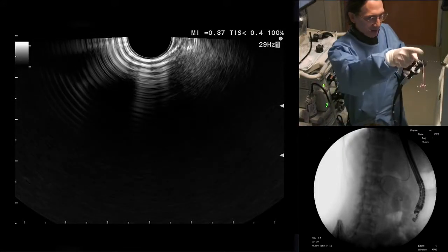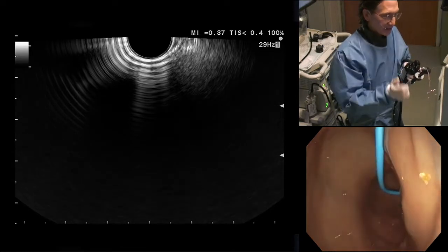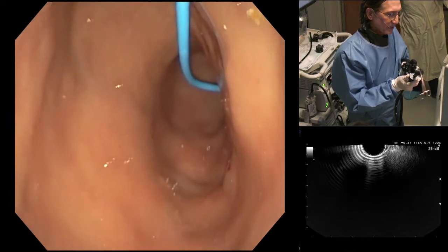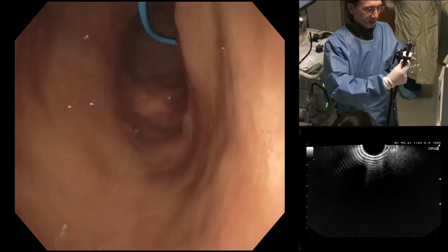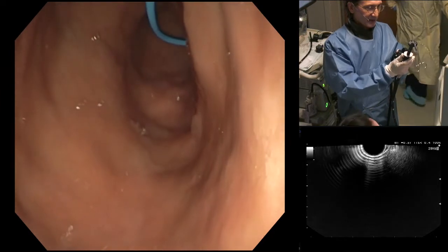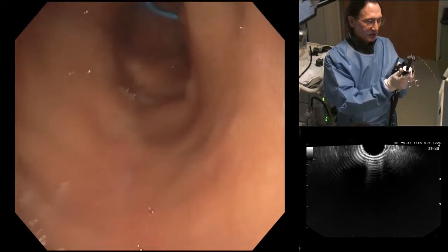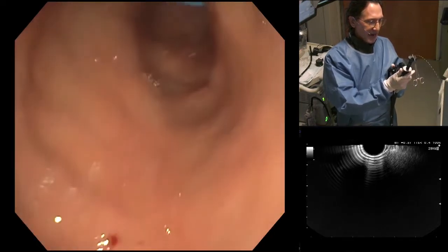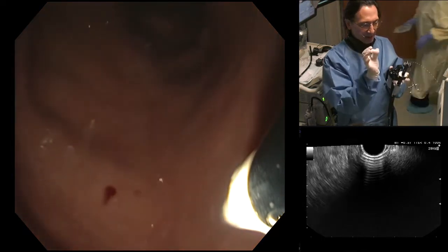If you see the endoscopic view, can you please put the endoscopic view at the bottom? Or in fact, make the endoscopic view large. And you'll see here in the lumen, I'm trying to advance. So if you're looking here at the camera view, you see I'm trying to advance the sheath. I'm hitting up against resistance, and that's not a good thing. If you push against resistance, you may accidentally start to deploy the AXIOS. All right, there it just popped out.